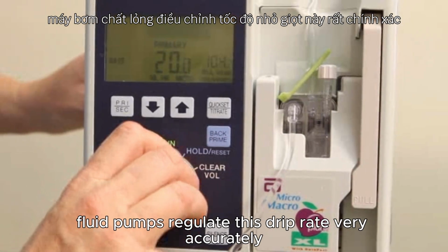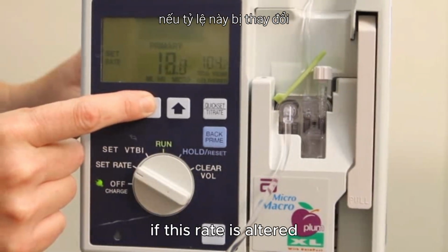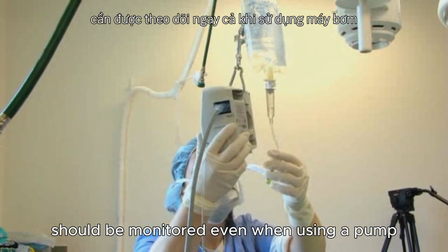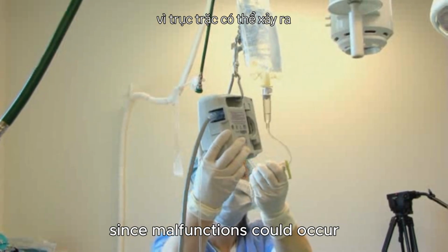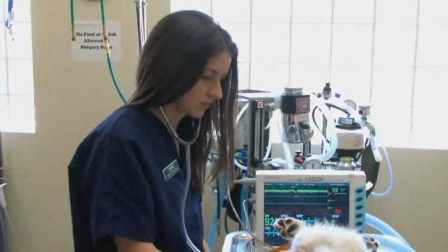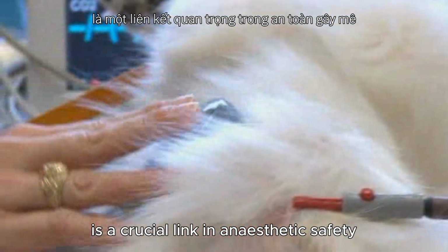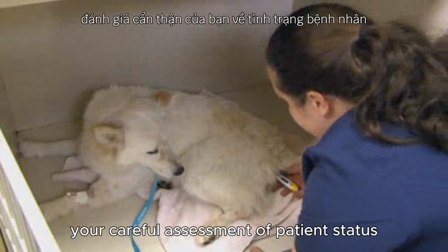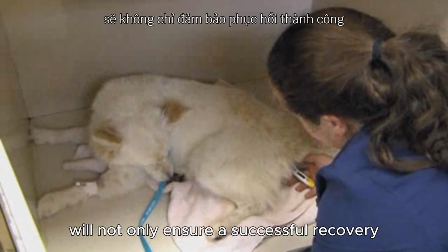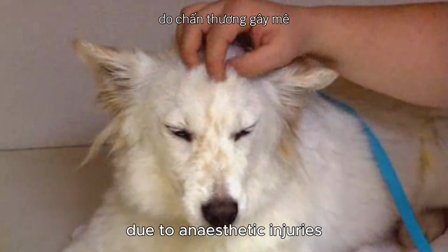Fluid pumps regulate this drip rate very accurately and can be programmed to alarm you if this rate is altered. The volume of fluids remaining in the bag should be monitored even when using a pump, since malfunctions could occur, leading to over or under delivery of fluids. Your surgical assistant's role in patient monitoring is a crucial link in anesthetic safety. Your careful assessment of patient status will not only ensure a successful recovery, but also reduce recovery time and avoid health complications due to anesthetic injuries.